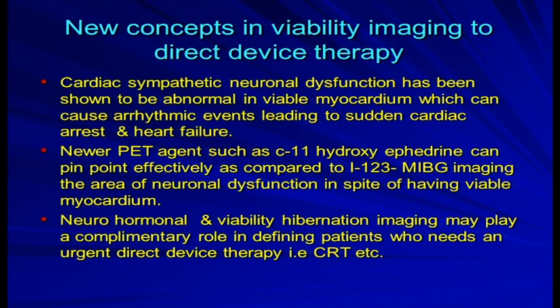So neurohormonal imaging and viability hibernation, which you can image with our nuclear medicine technique, may play a complementary role in defining patients who need an urgent device therapy, that is CRT and so on.